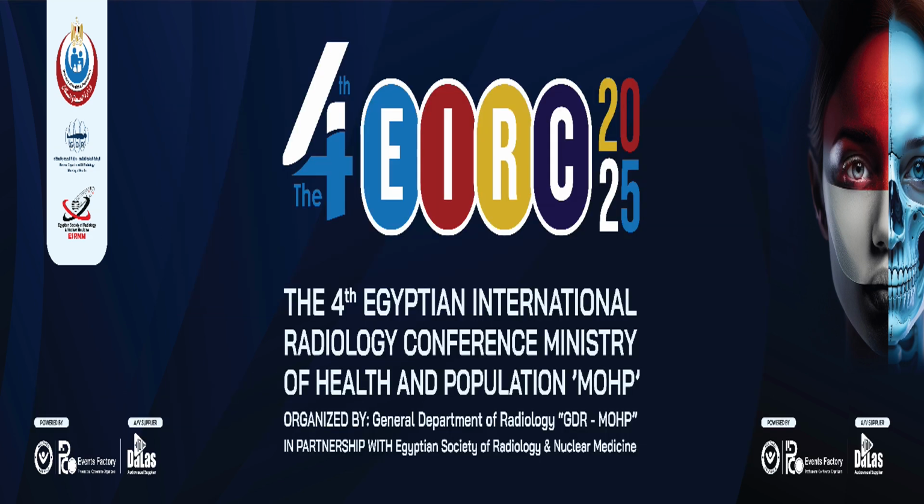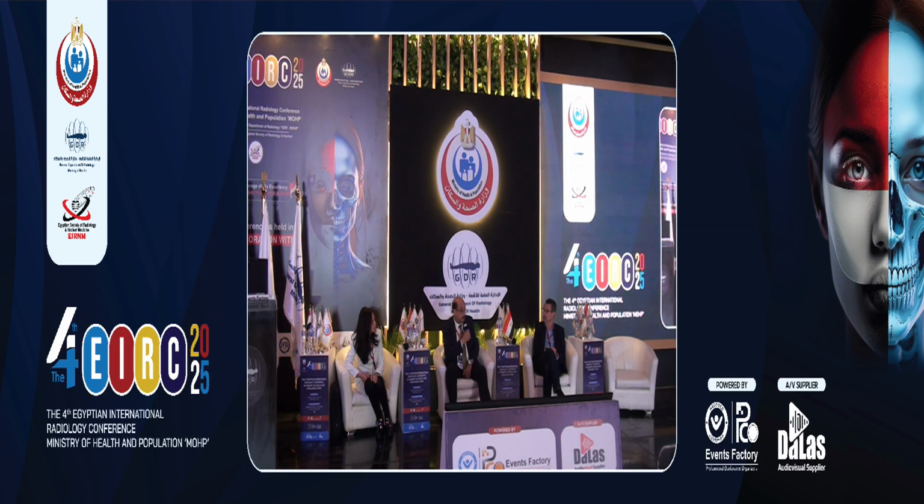Thank you, Dr. Shady. Now, I have a question for Professor Hisham. I'm asking about your experience with glue embolization in post-traumatic pseudoaneurysm, either in the renal artery or in the GDA, because in our institute, usually we use Histoacryl in treating such cases.